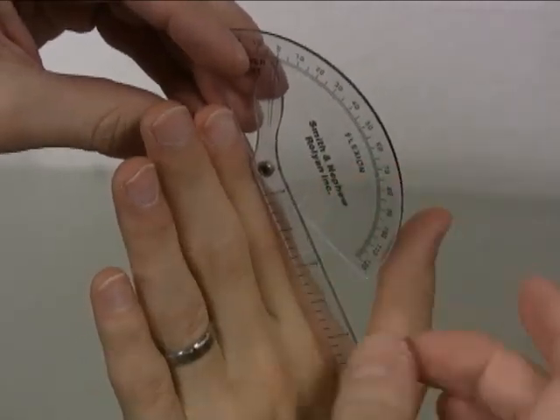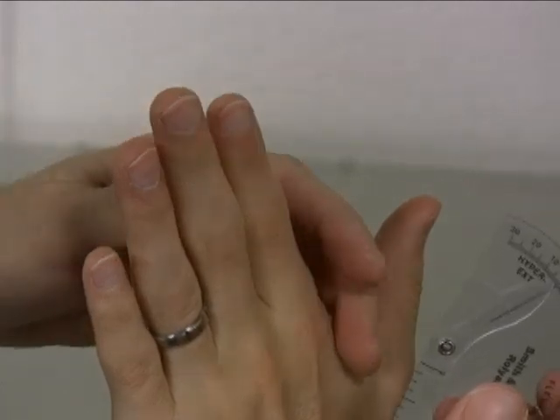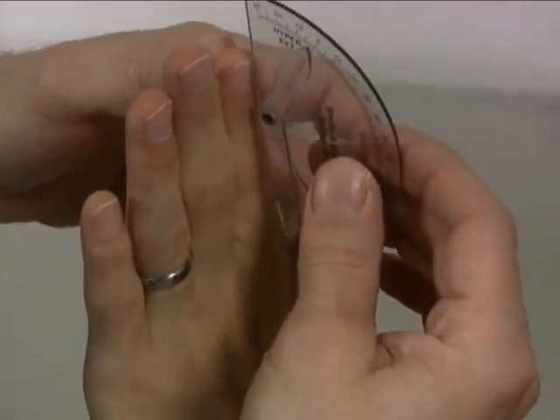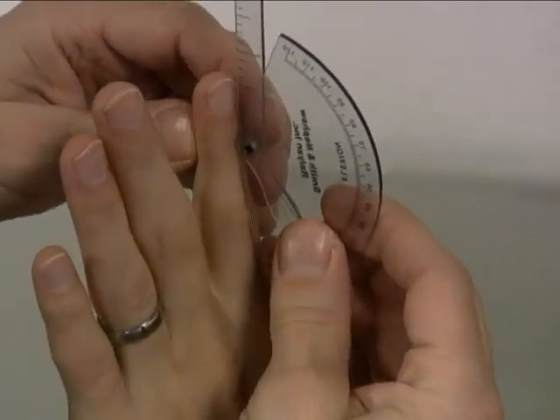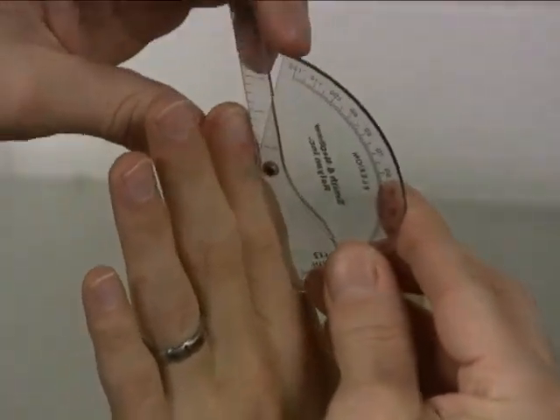Again, with a longer lever arm like this, if the patient really kicks that finger back, you're going to be bridging several joints, and you don't want to do that. So I might flip this around to make sure we're only measuring one joint at a time.